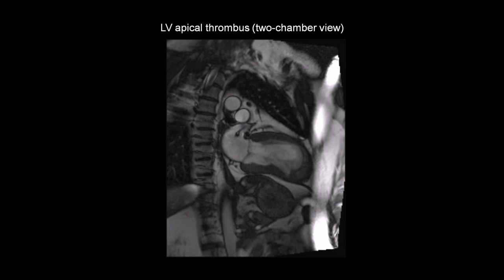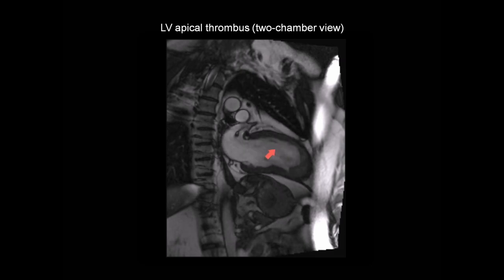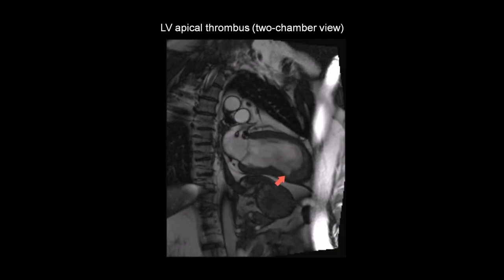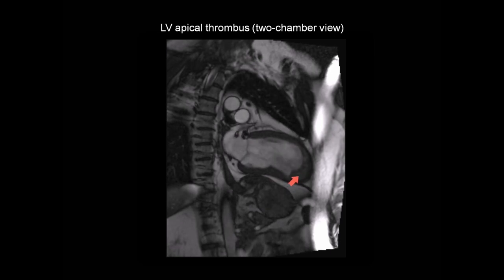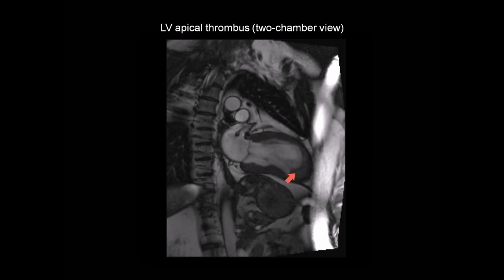This is the same patient with an ischemic cardiomyopathy. This is a cine-CMR taken in the two-chamber view. We have the left ventricle, the mitral valve, and the left atrium. And once again, we can see that the left ventricular apex has been affected by a myocardial infarction — it's dyskinetic, and there's this large laminated apical thrombus present at the apex.